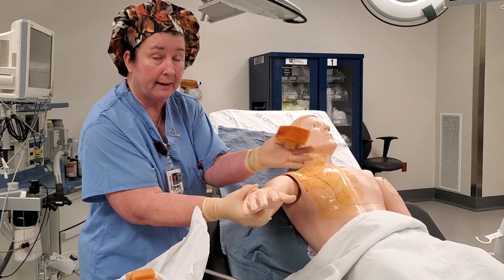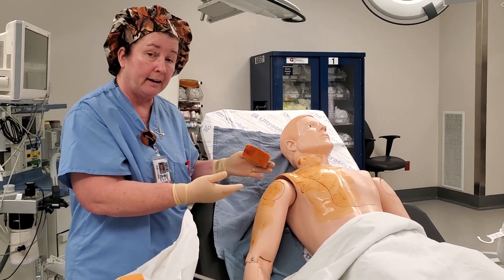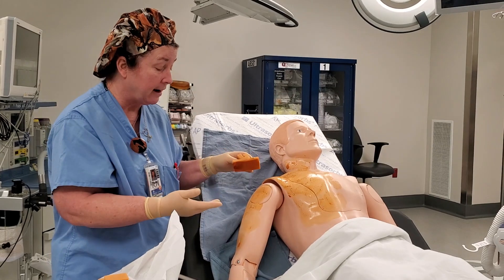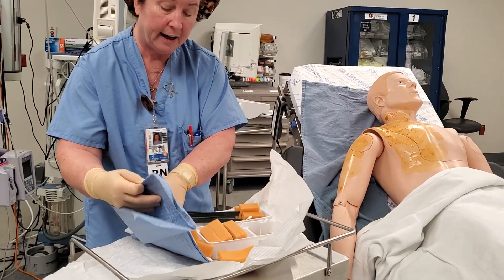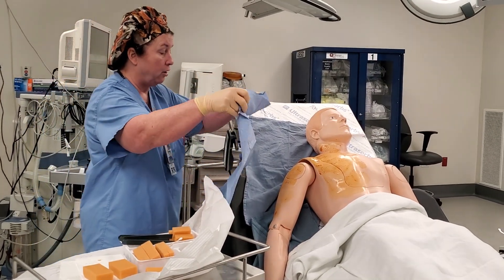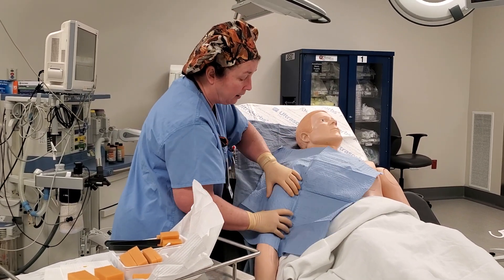The hand would be the last thing prepped and you would throw the sponge away. When using iodine scrub, you need to scrub three times over the entire area. Once you get it all scrubbed, you'll take one of your blue sterile towels and place it over the area that you prepped. Blot — do not rub in any way.